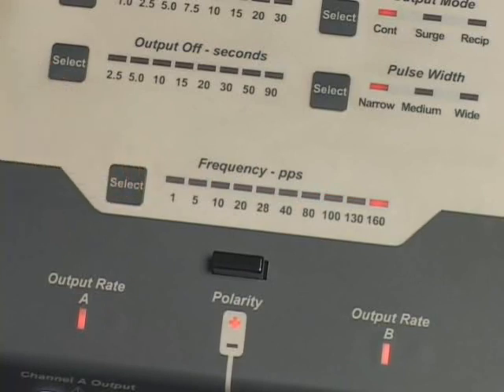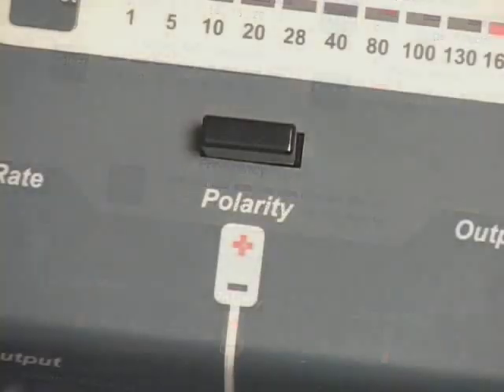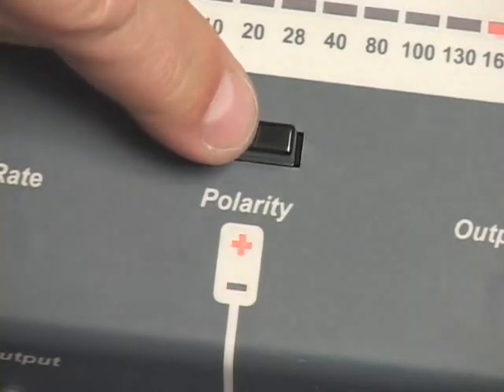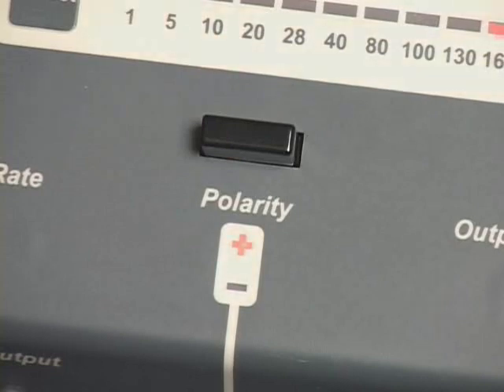The channel A and channel B output indicator lights will reflect the pulse frequency selected. The output pulse frequency selection can be changed at any time during treatment. Press and release the polarity control to select the polarity for the black reference output jacks. The polarity indicator light array indicates the polarity selected for the black reference jacks. The polarity selection can be changed at any time during treatment.